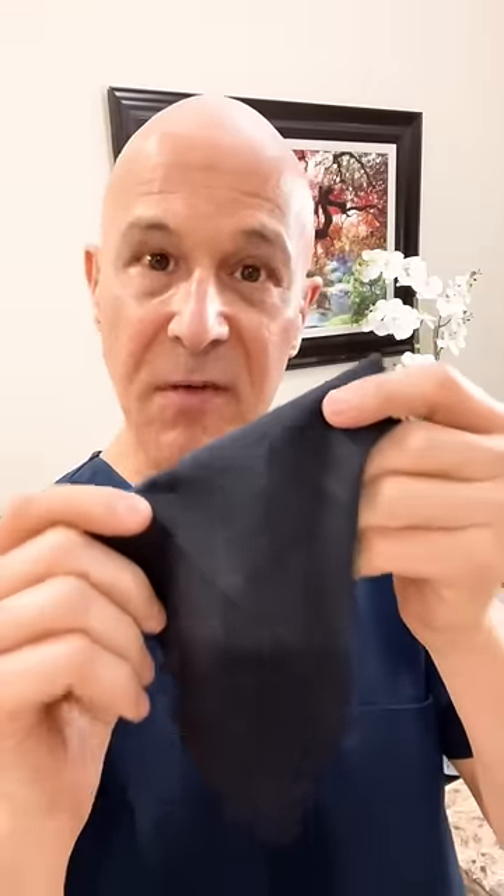It's important to rinse your lenses first with warm water to wash away that debris that can cause those scratches. And when you wipe your glasses, you must get rid of that debris or it will cause more scratching. The best way to wipe your glasses clean is to use a microfiber cloth.